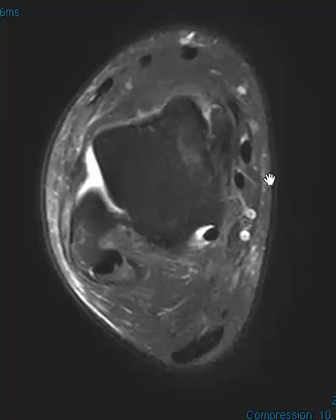Hello, this is Dr. Gay from First Look MRI, and this is a patient who had a recent sprain of the ankle playing basketball. This is a very basic classic case.